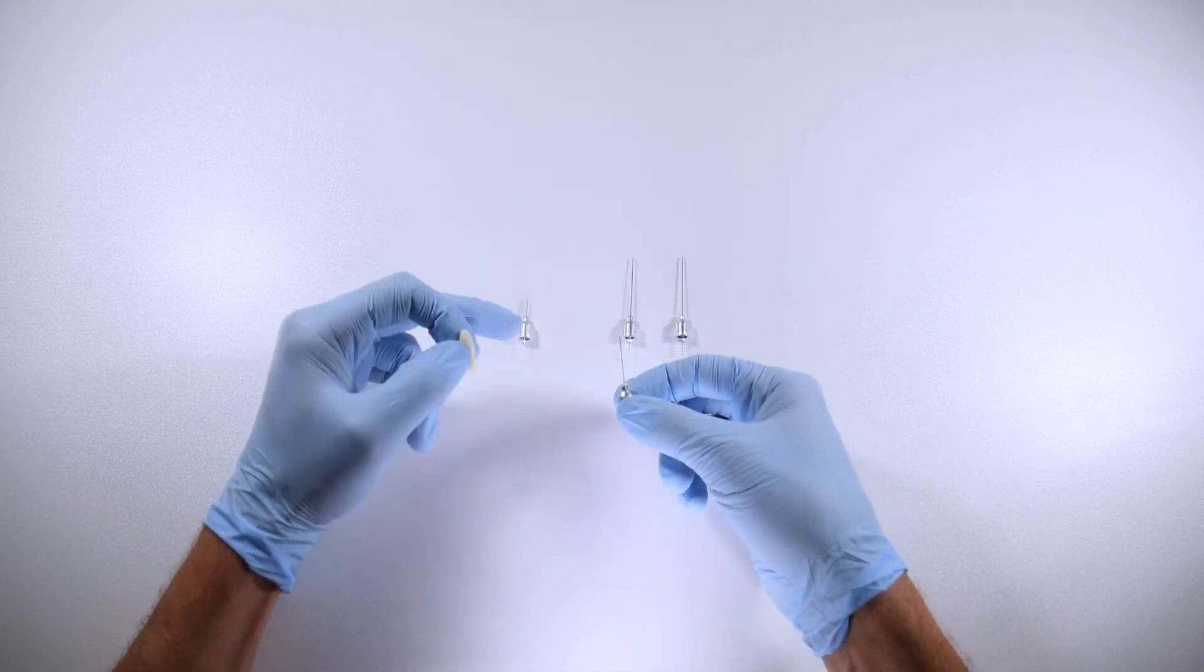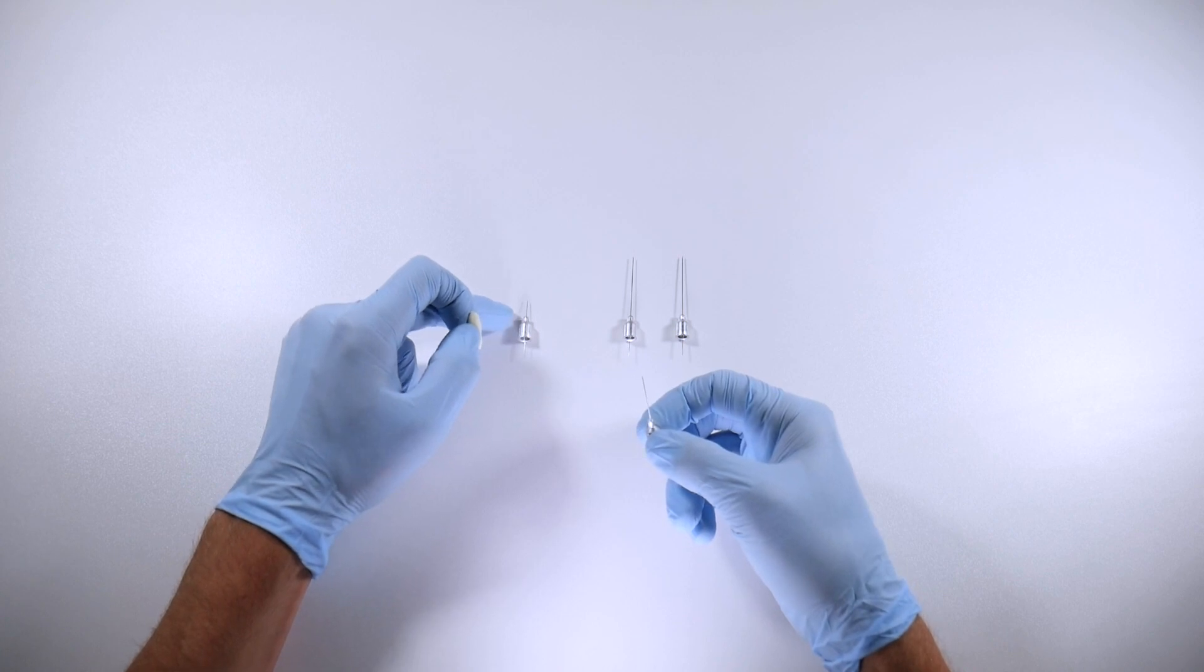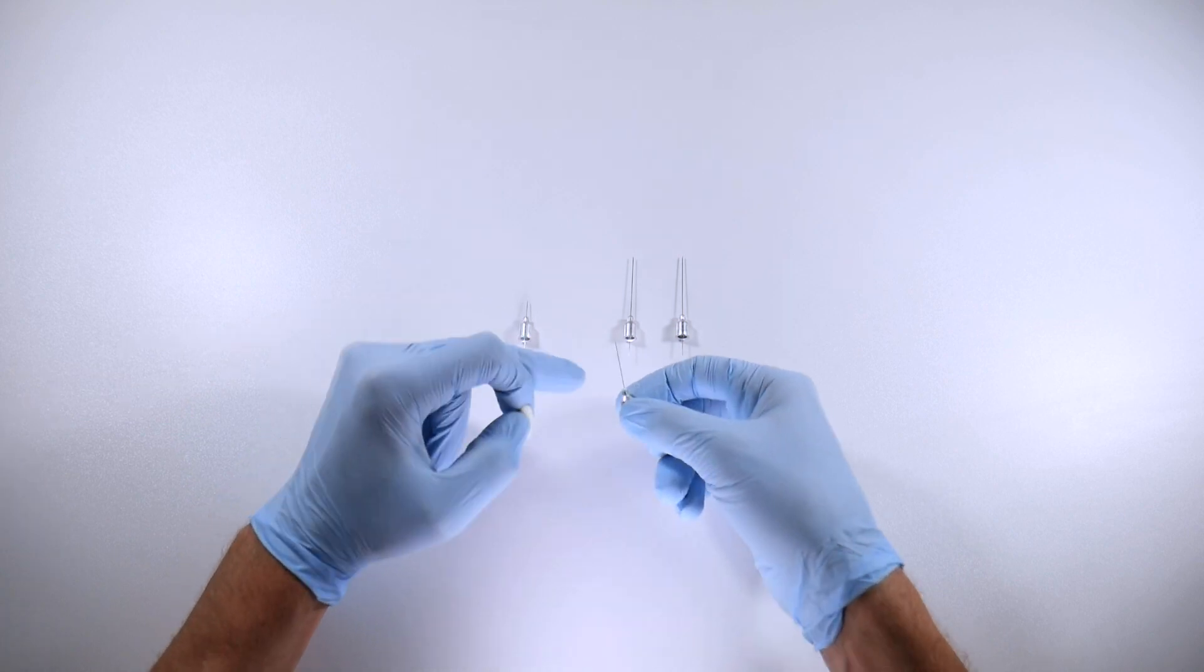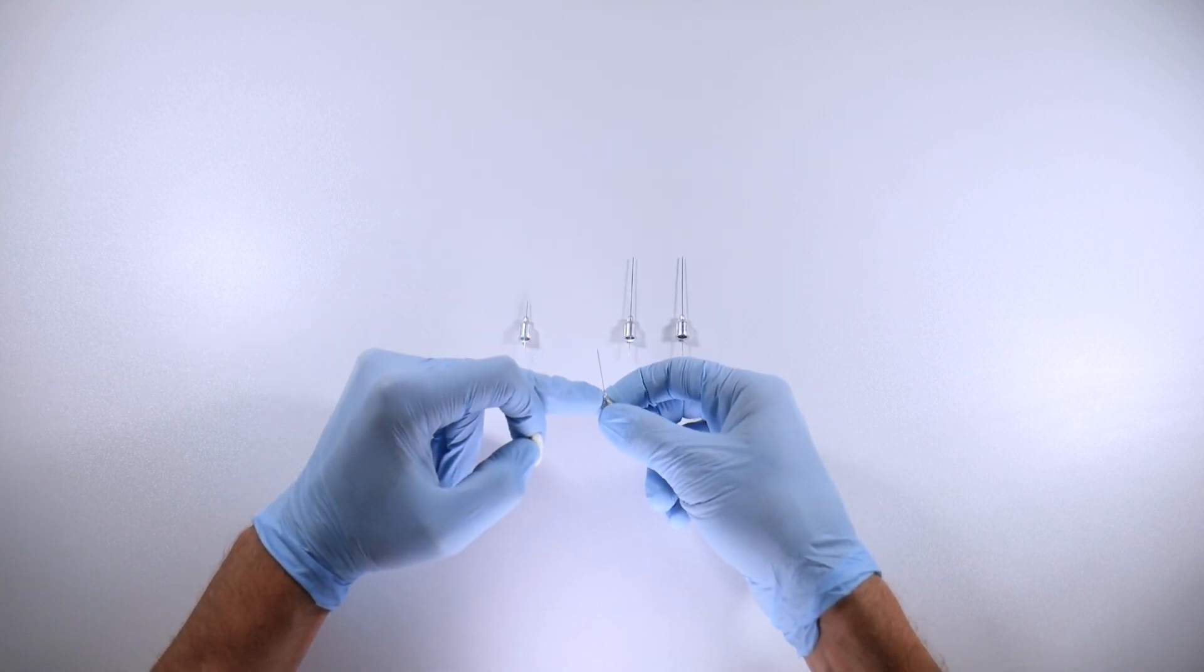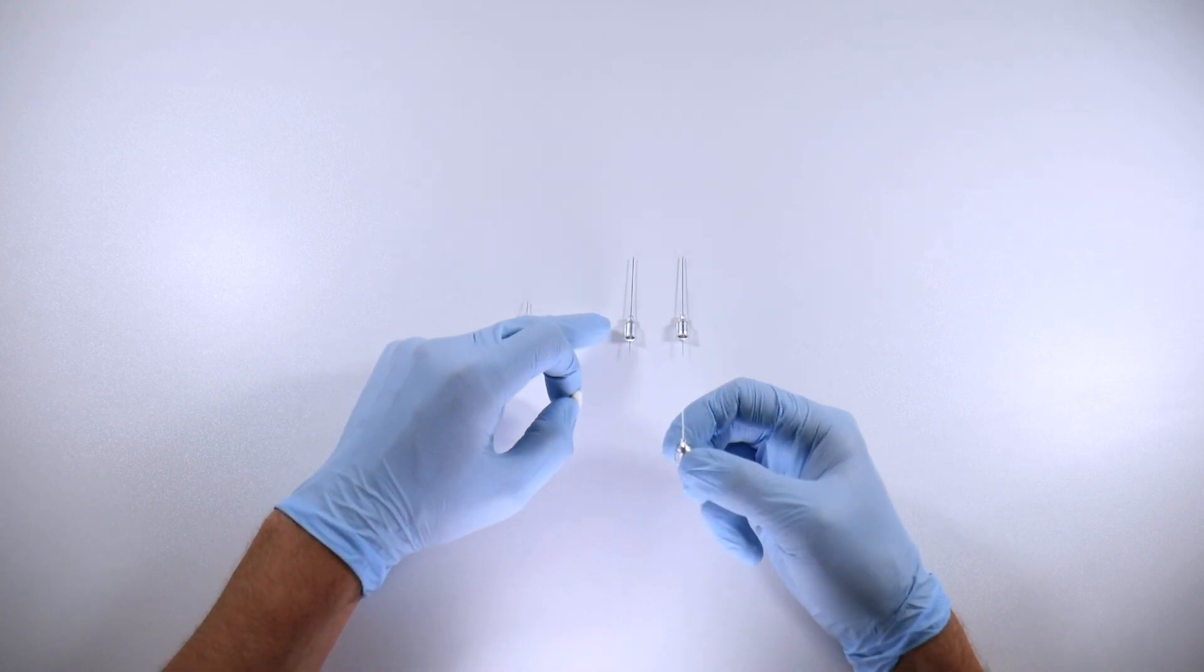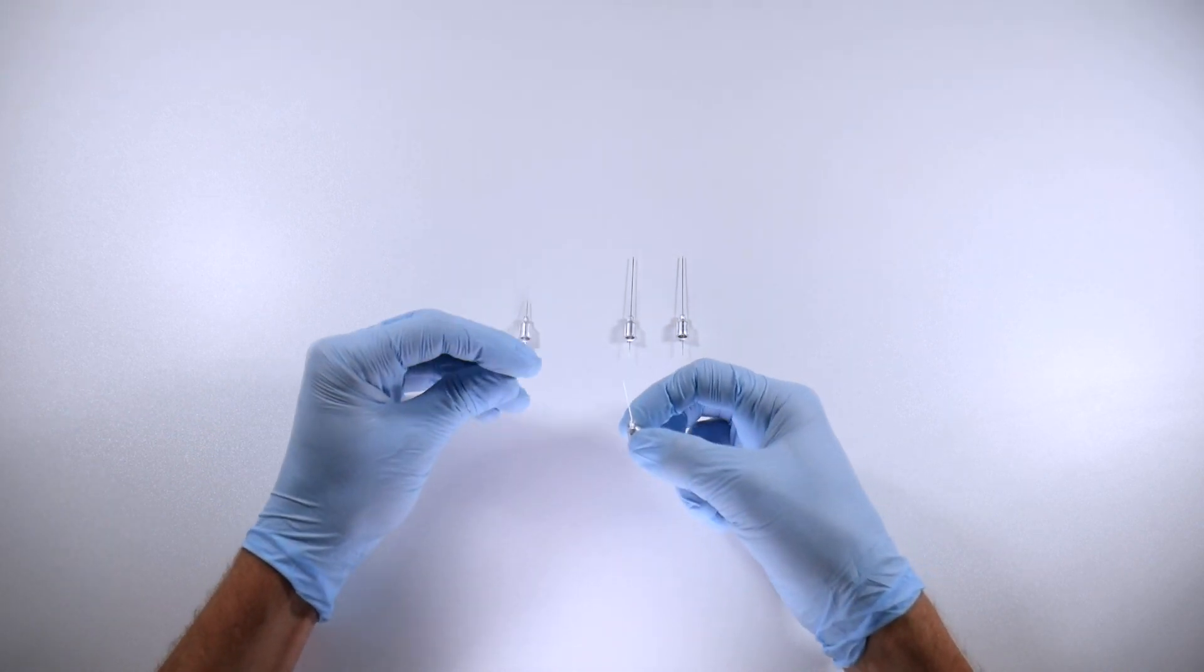One thing to think about is you've got 13 millimeter length on your extra short, you've got 20 millimeters of length from the hub to the tip of the needle on your short, and then your long needles are 32 millimeters from the hub to the tip.